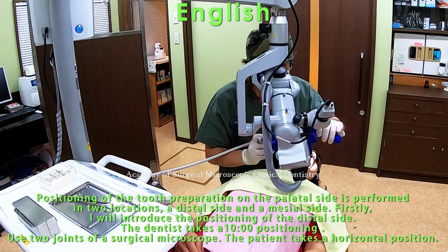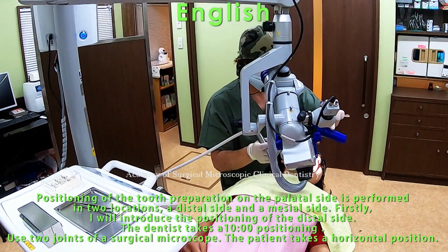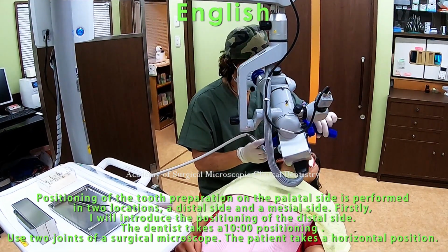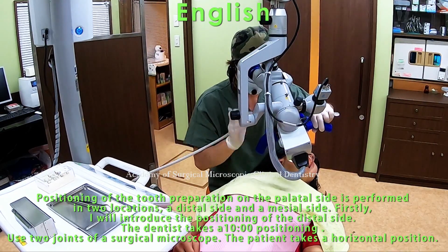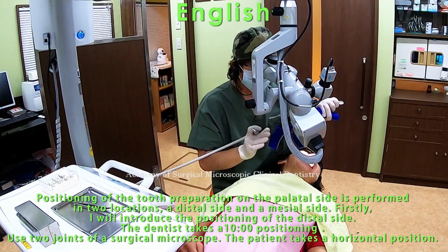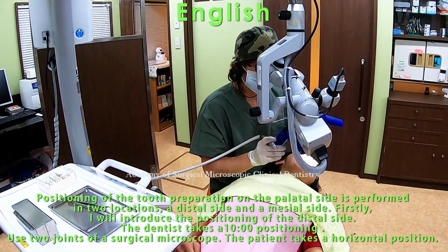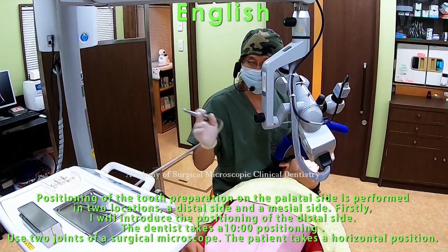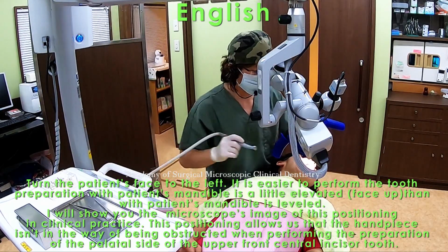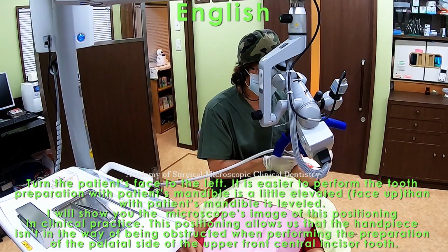Positioning of the tooth preparation on the palatal side is performed in two locations, a distal side and a mesial side. Firstly, I will introduce the positioning of the distal side. The dentist takes a 10 o'clock positioning, use two joints of the surgical microscope. The patient takes a horizontal position, turn the patient face to the left. It is easier to perform the tooth preparation with the patient's mandible a little elevated.